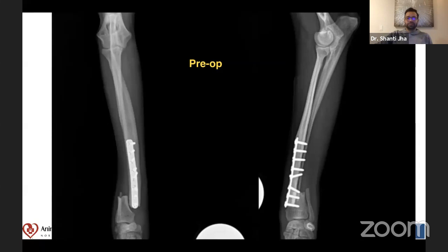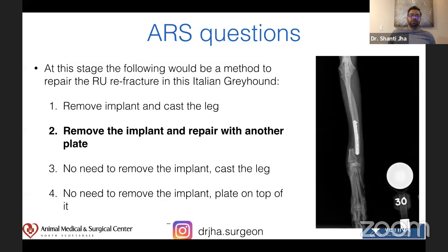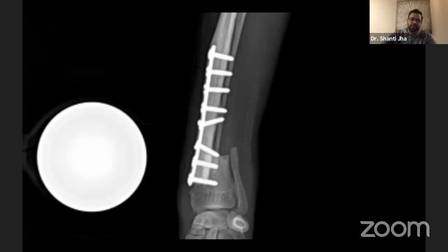So what would you do here? Well, I chose that I'm going to go in, remove the implant, and then put another plate. And this is many, many years after the fracture was repaired. You can see that the plate, almost from the proximal, is getting engulfed by the osteoblasts and osteoclasts. The bone is trying to grow onto the plate, and that's how the body repairs itself. It's just standard remodeling, nothing special.